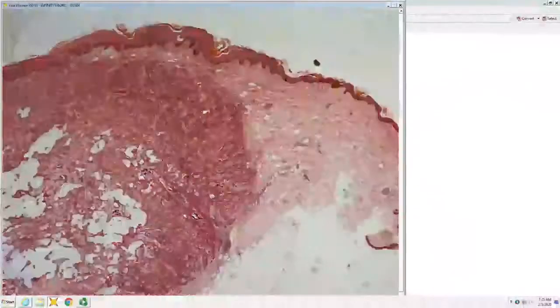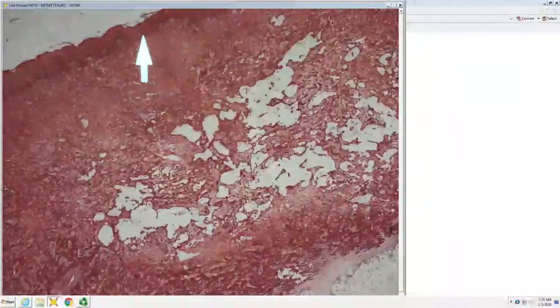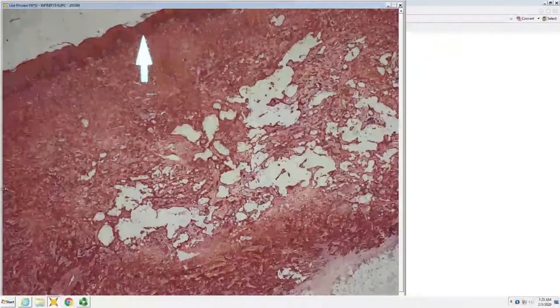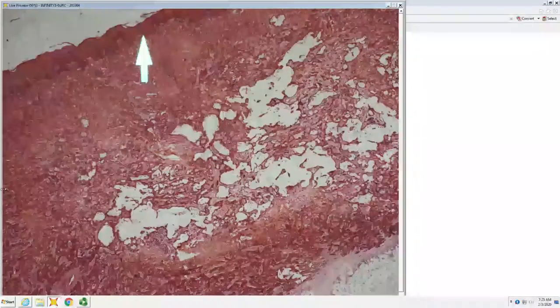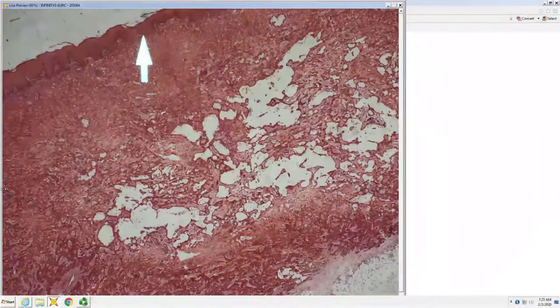By pattern, and not quite clear whether it connects to the epidermis. This happened to be a metastatic squamous cell carcinoma from cervix. But it could be a primary cutaneous squamous cell carcinoma out of plane of section. Epidermotropic metastasis definitely happens, where things, especially squamous cell carcinomas, can reattach to the epidermis and can look like primary carcinoma. So you have to bear the possibility of metastasis in mind.